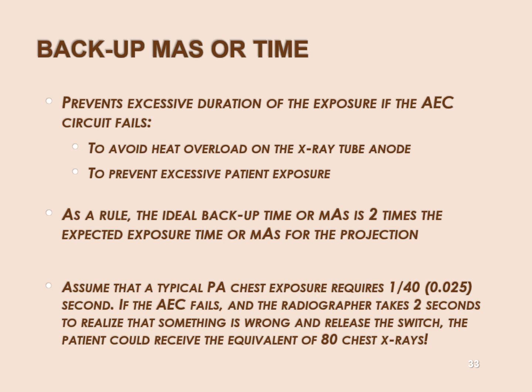So the backup time should be at least 2 times the expected exposure. So you should have a reasonable idea, even if you're using AEC, of what mAs you're going to be drawing, and then the backup time should be about twice that, okay? Because you don't want to underexpose, okay? Because that would be the thing that would lead to a repeat.